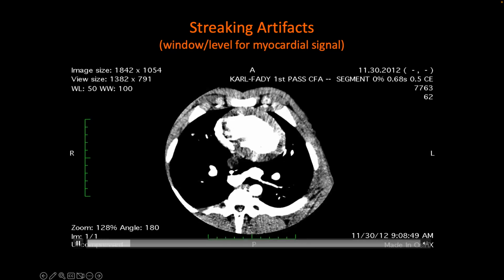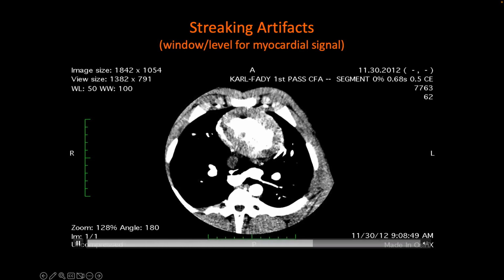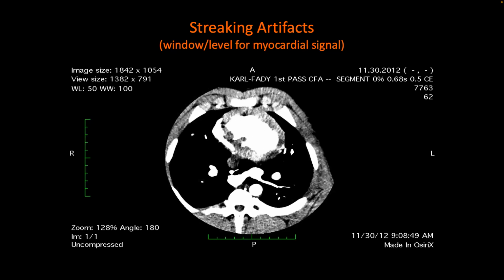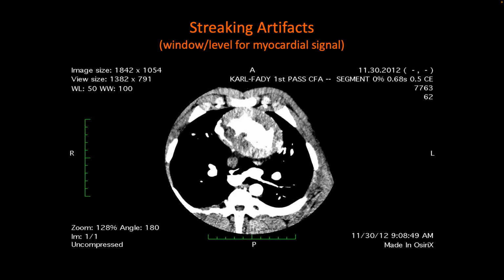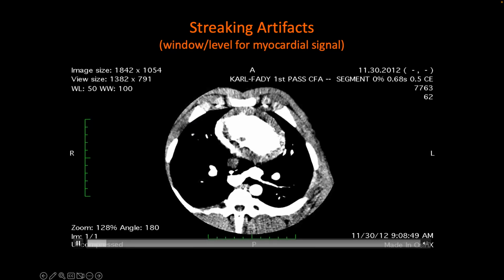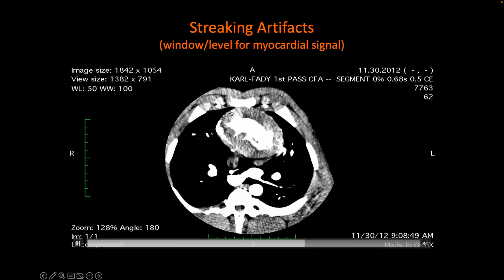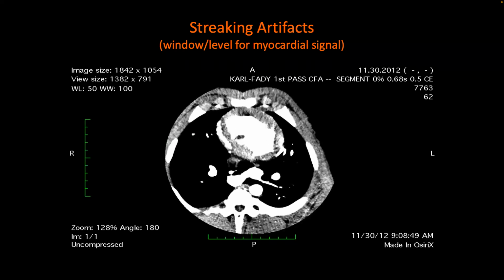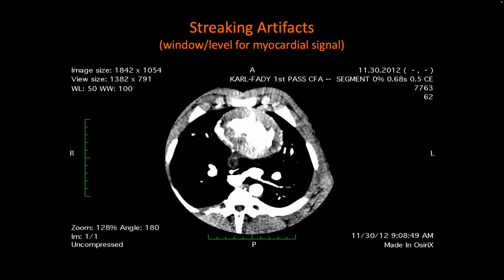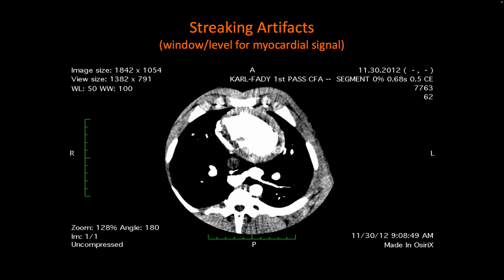And so we're getting a lot of this artifact. In this case, this is very exaggerated. You can push this down with some simple stuff, but the fundamental is true that the variability in the myocardial signal from the surrounding artifacts is quite high versus the amount of change from the inflow of contrast into the myocardium. So hence, it doesn't work in everybody.